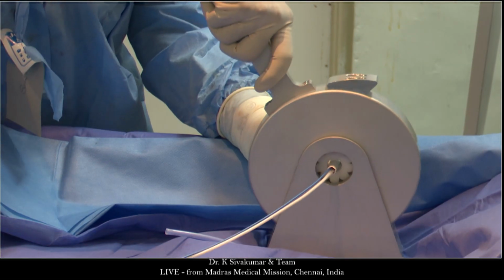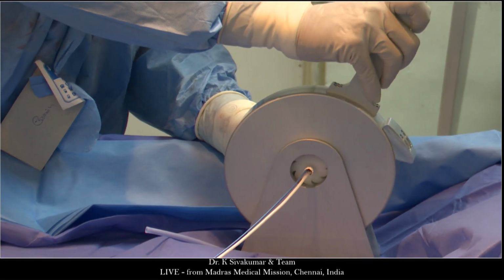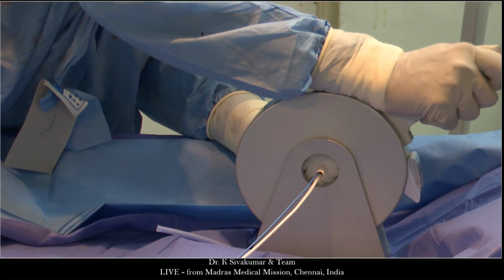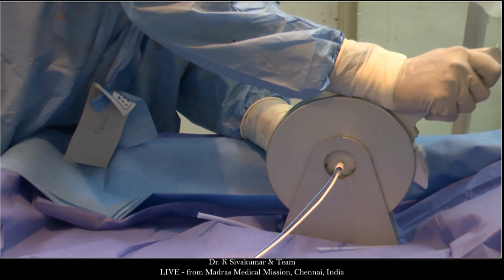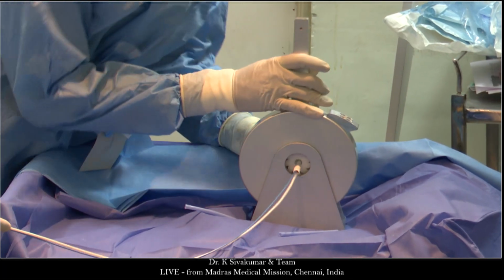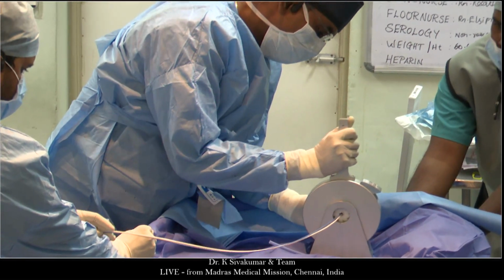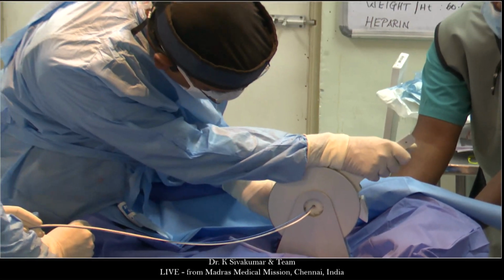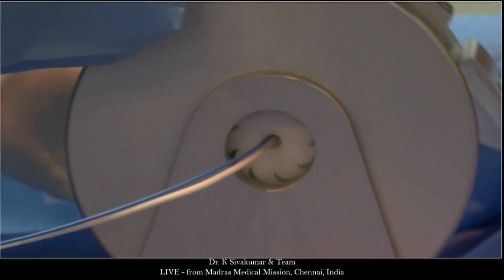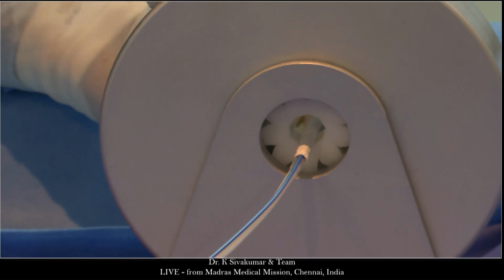So Sivakumar, you said the Z-Med diameter is 18? The Z-Med diameter is 24, but length is 8 centimeter. See, I'm using the crimper. This is a crimper made by Zephyr. I'm standing on the opposite side in order to show you the video. And in the groin, you have a dry seal sheath? I have a 24 French Cook sheath.